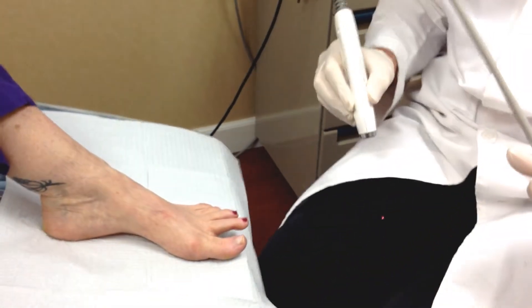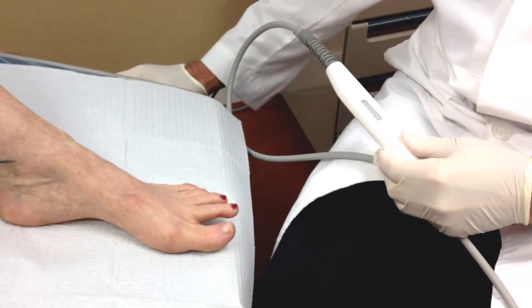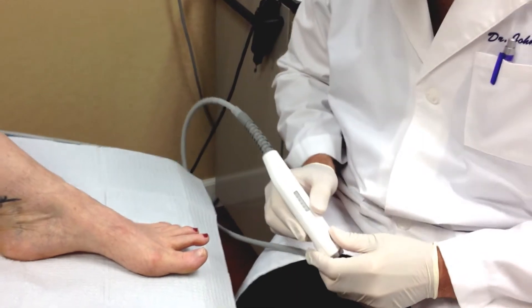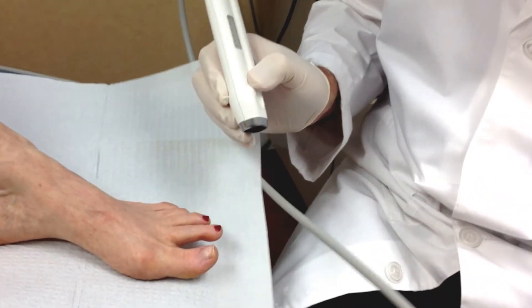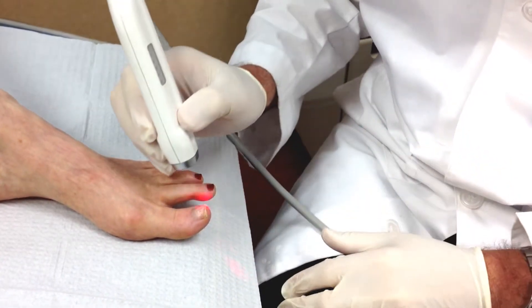So we're going to go ahead and treat this. There's very little discomfort. Usually patients can feel a warming sensation. Sometimes it gets a little bit hot, but the hotter the better — the more effective the treatment.